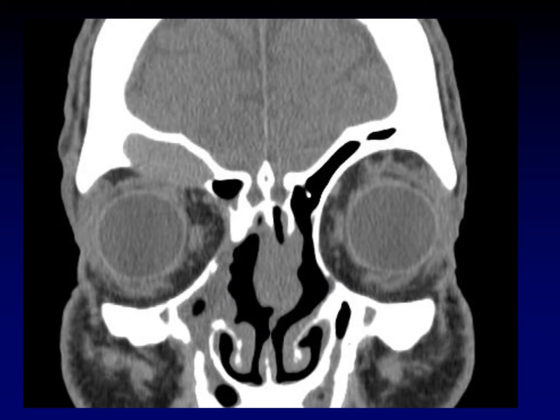A mucocele is what happens when you obstruct a sinus or a portion of the sinus and the mucus accumulates within it and expands that sinus. This is a mucocele of the frontal sinus, and you can see it pressing down on the roof of the orbit. You can imagine the mass effect that that would have — this patient will present with exophthalmos.